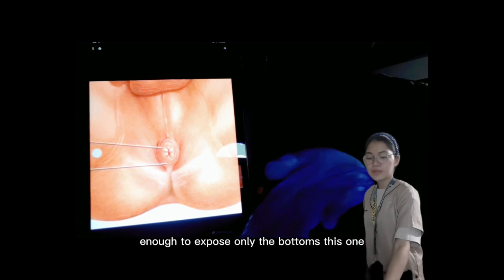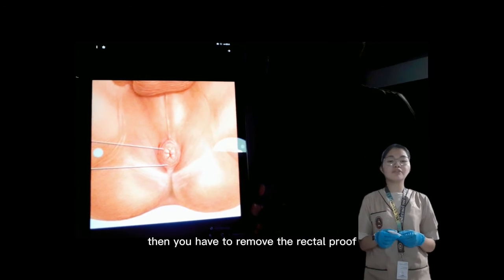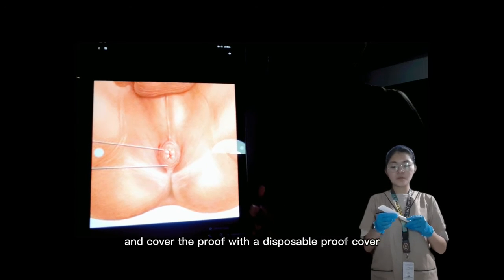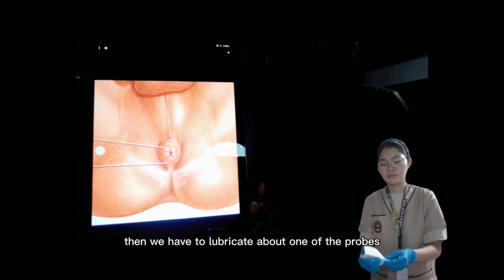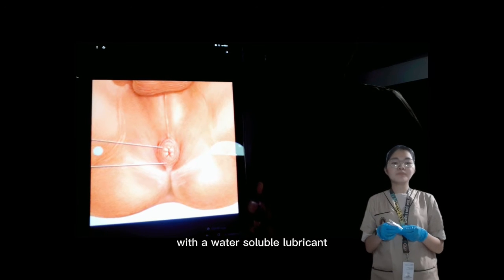This one. Then we have to remove the rectal probe from within the recording unit of the electronic thermometer and cover the probe with a disposable probe cover and slide it into place until it snaps in place. Then we have to lubricate about one inch of the probe with a water-soluble lubricant.